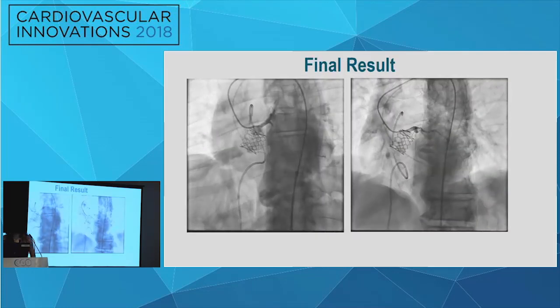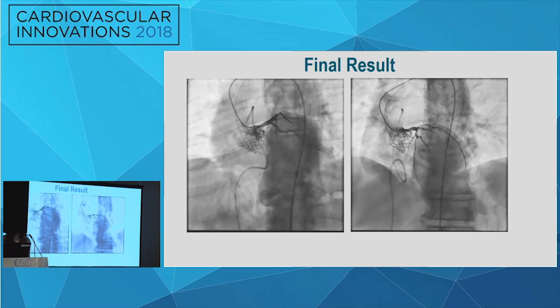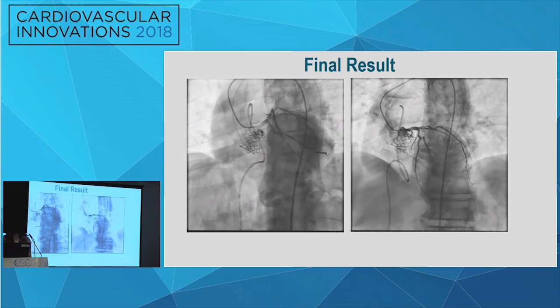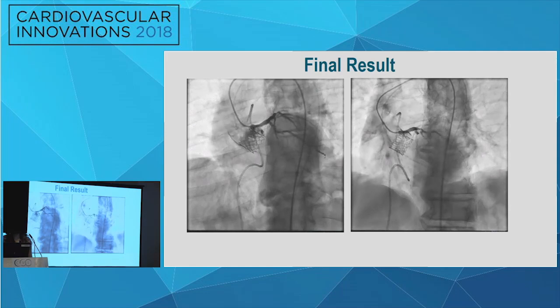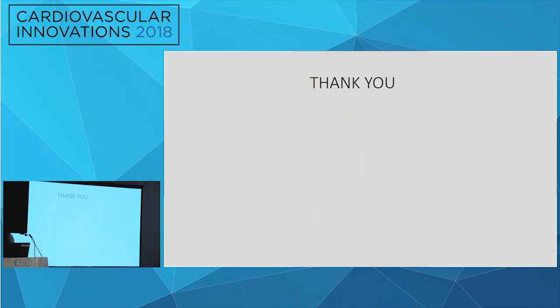And then these are the final angiographic shots. And so we had to extend the stent outside the ostium. That's what's been suggested by prior case reports and studies to prevent the radial compression by the tissue. So he did well, no symptoms after this. It's a good case.